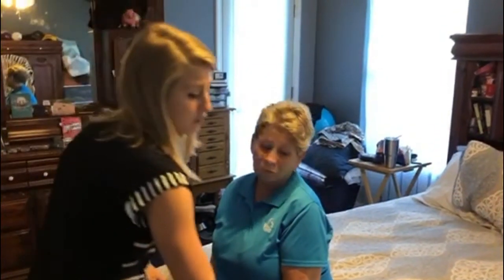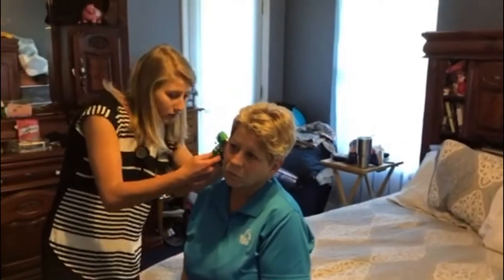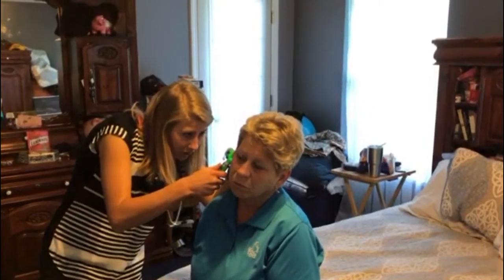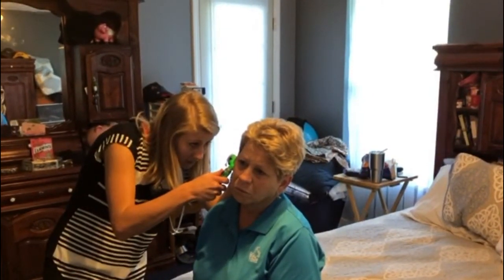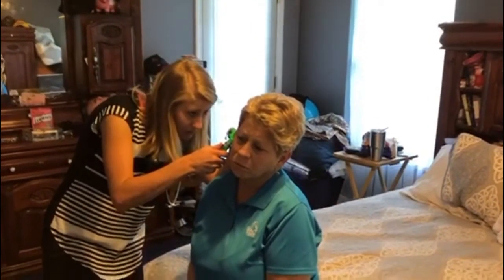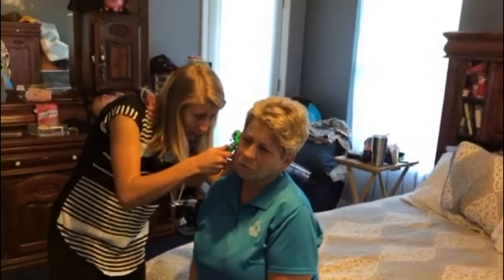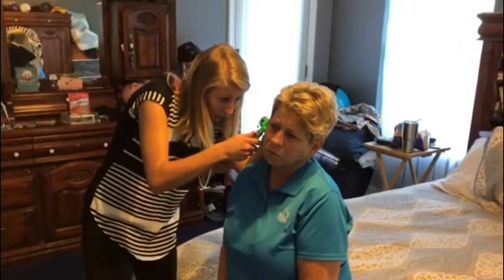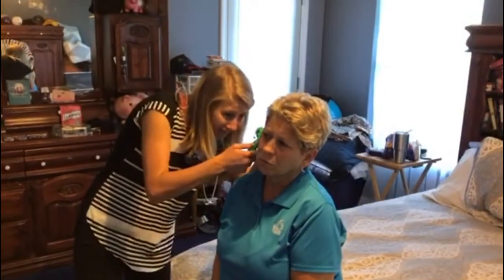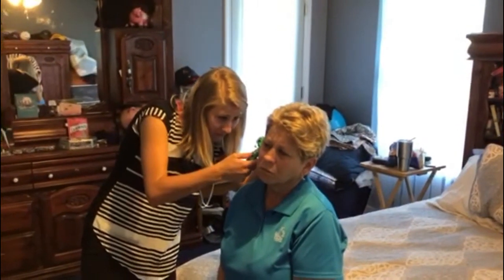I'm next going to grab my otoscope and take a look inside of your ears here. There is a little bit of cerumen, but I can see the tympanic membrane. It is pearly gray. I do not see any perforations or abnormalities. There is no redness or swelling over here, which are all normal findings. I can also see the bony prominences landmarks.